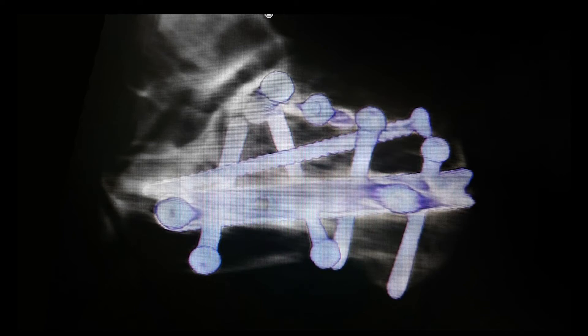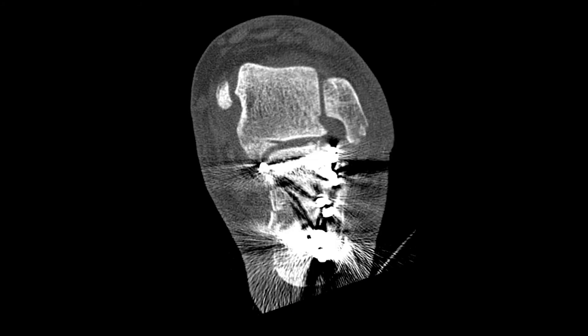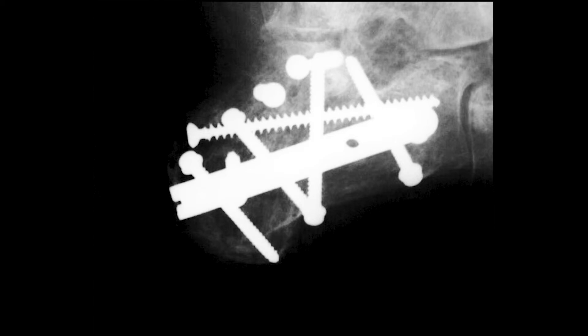Post-op CT scans show that the articular facet is restored close to the original anatomy. Mild displacement of the fragments was considered acceptable given the closed technique in an elderly patient with a high risk of complications. The height of the calcaneus was restored and its shape was correct. The fracture united without loss of height.